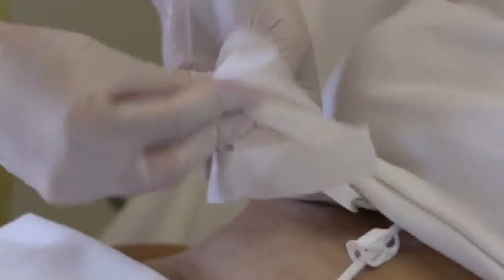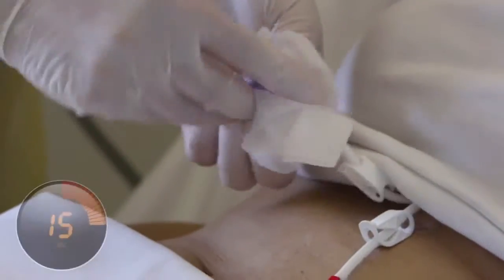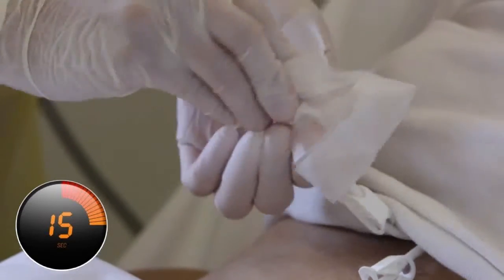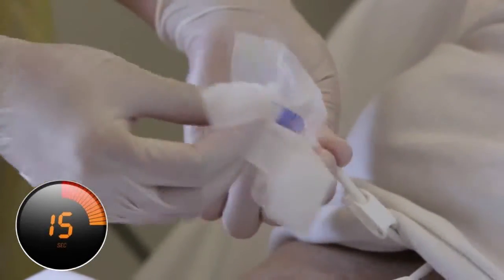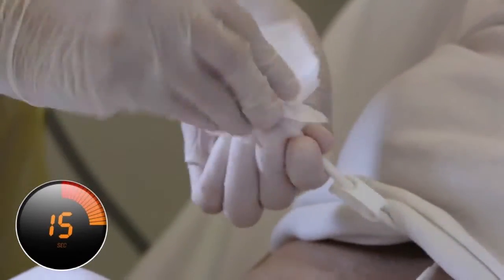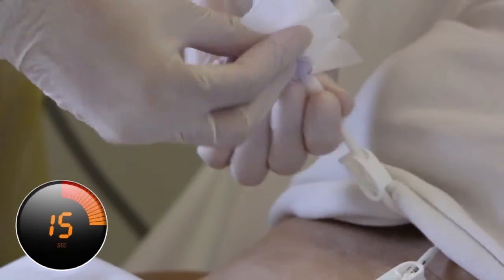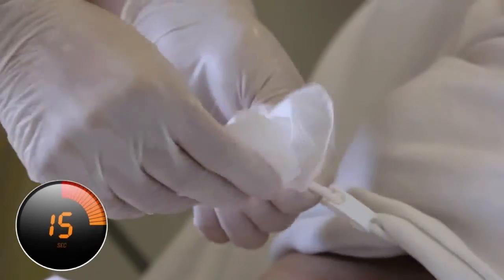Open a chlorhexidine wipe carefully and thoroughly scrub the port for 15 seconds, creating friction whilst doing so. The hub shown on this line is a needleless hub which allows access to the line without needing to remove any caps. It also prevents air from entering the line whilst changing syringes, so there is no need to clamp after each syringe disconnection.